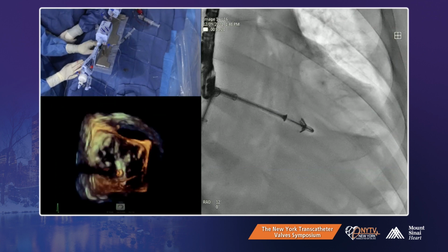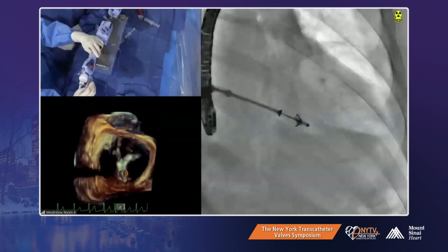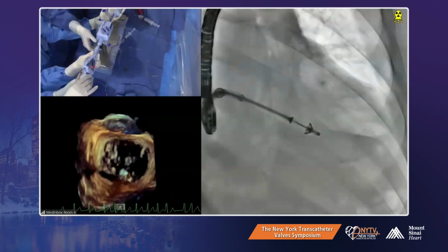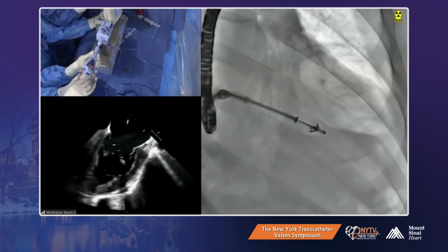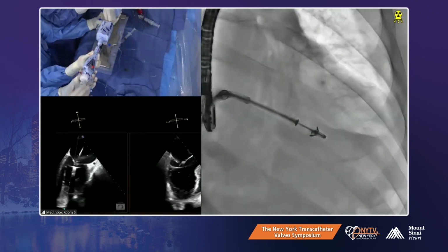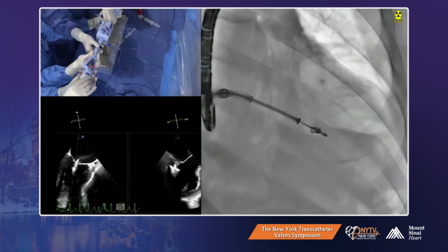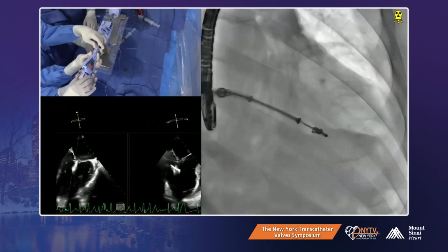Yes, I think that's kind of the feeling. Make sure everything's working. Let me see. Try to come in with an optimal orientation. Okay, 2D, quick. No, invert. Invert. Yep. Then we can come back to increase the azimuth.